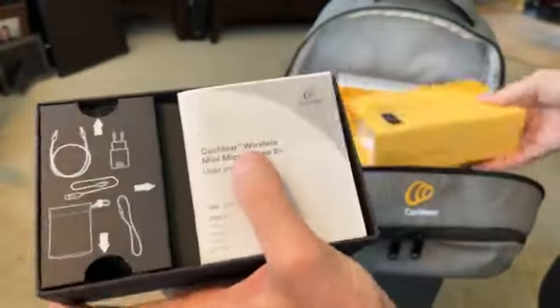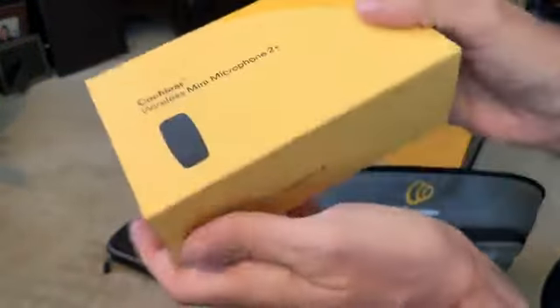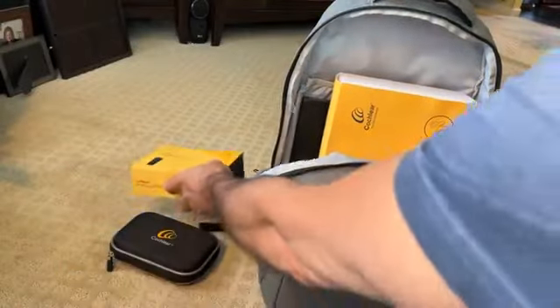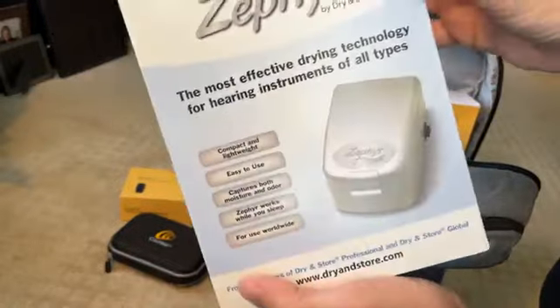One of your accessories — if you get the Cochlear brand, you get three initially, then they give you a year to pick a fourth one. That's the mini microphone. One thing that's not an accessory but just comes with it is the dryer.